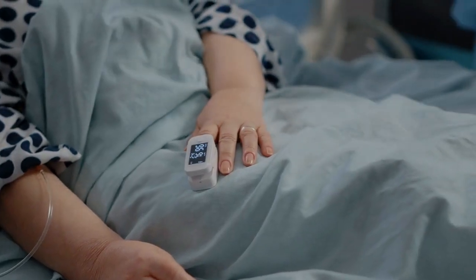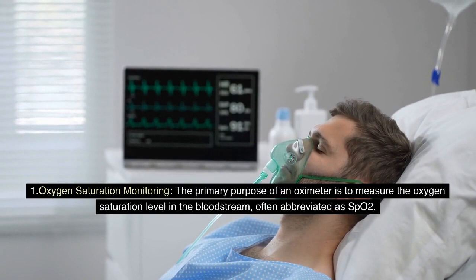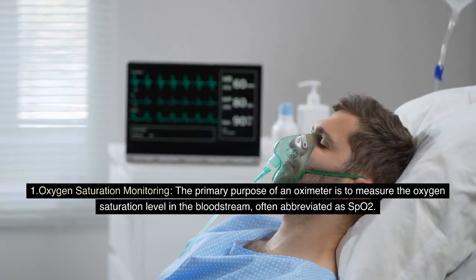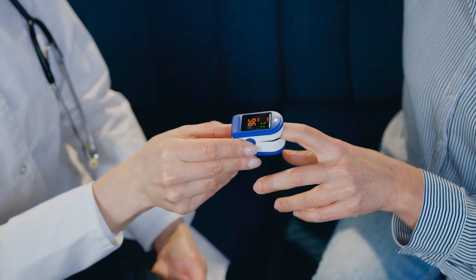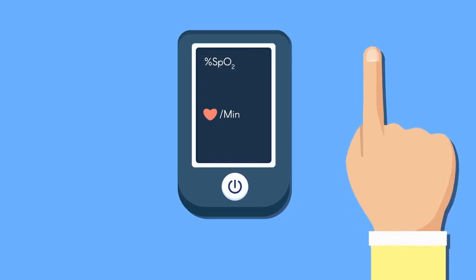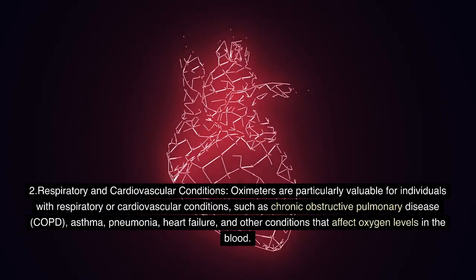The main purposes of an oximeter include: 1. Oxygen saturation monitoring. The primary purpose of an oximeter is to measure the oxygen saturation level in the bloodstream, often abbreviated as SpO2. This measurement indicates the percentage of hemoglobin, the protein in red blood cells that carries oxygen, that is saturated with oxygen. It provides crucial information about how well oxygen is being delivered to different parts of the body.